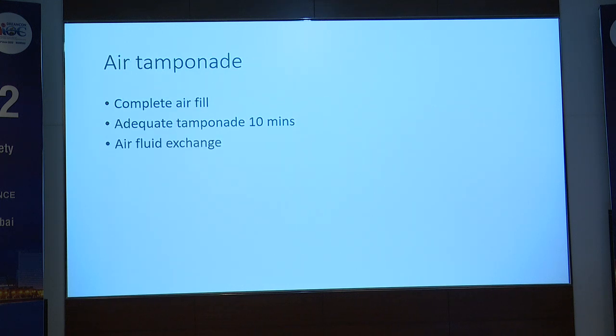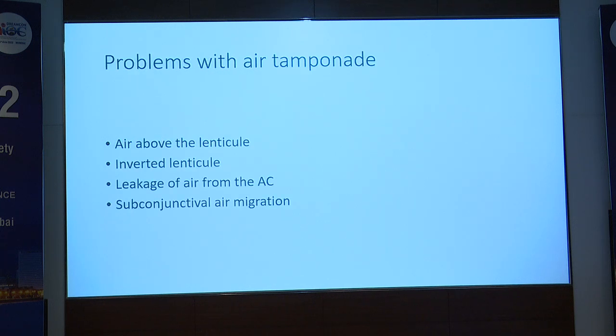Air tamponade: in the initial cases, try to have a complete air tamponade, and maintain it for a longer time. At the end of it, you can just burp a little bit of air to prevent pupillary block, so that the patient's IOP doesn't increase.